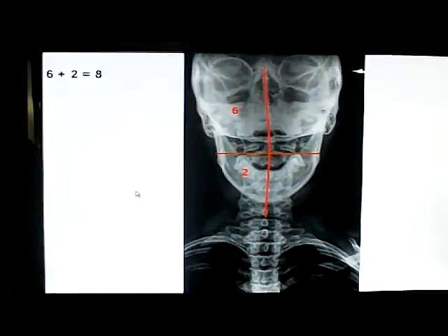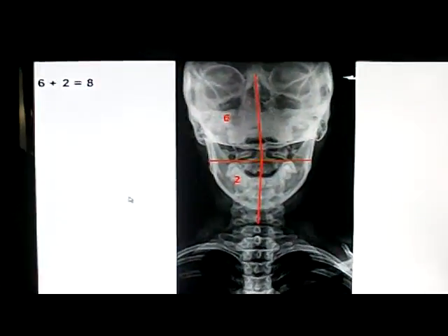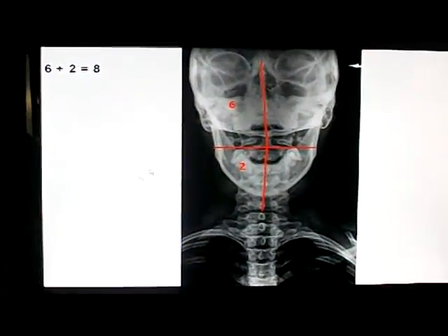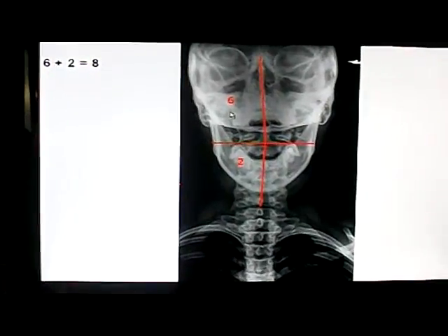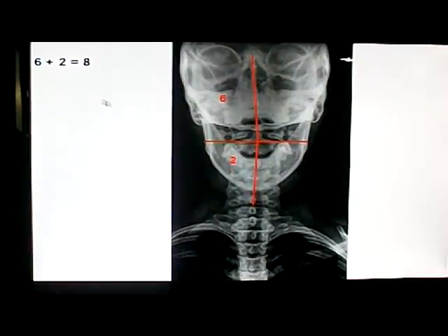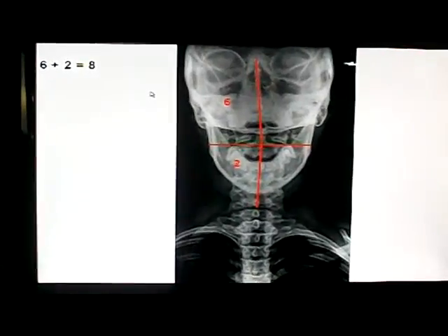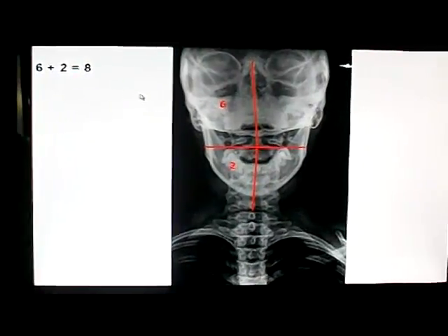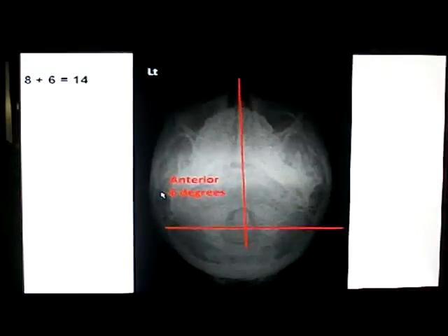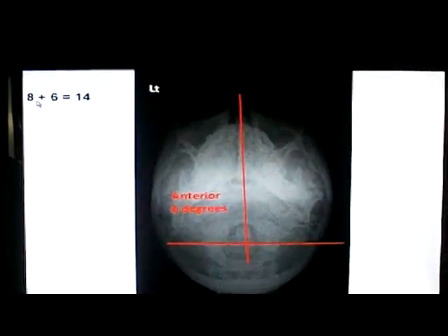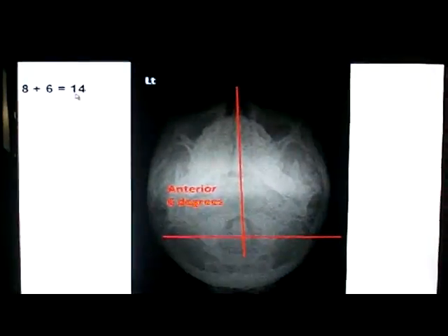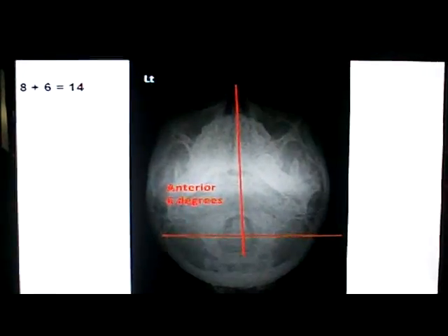Now let's go back and add all these together to see what's really going on in regard to the vertebral subluxation. We've got an upper angle of 2 degrees, or 6 degrees. A lower angle of 2 degrees, which gives us a total of 8 degrees — these are both on the same side. Then we've got 6 degrees of rotation. So going with the upper and lower angle of 8 degrees plus 6 is a total of 14 degrees of subluxation in the upper cervical spine.